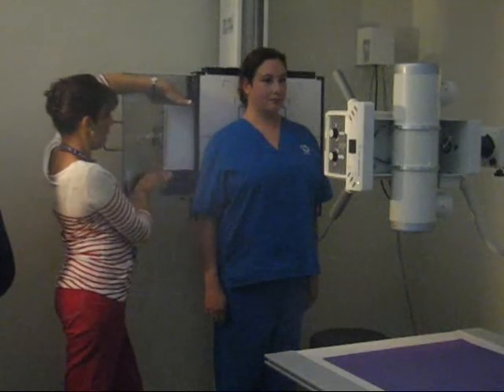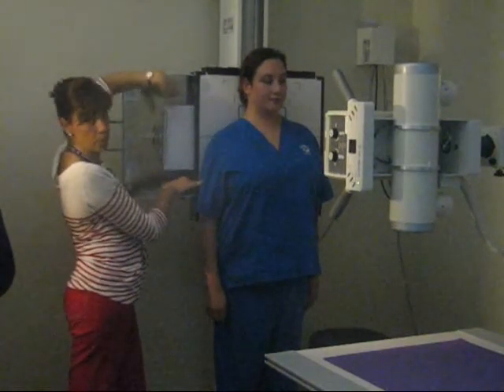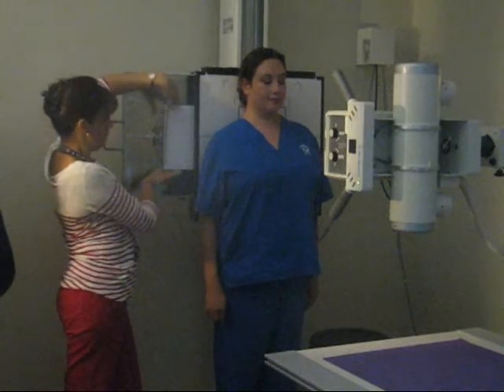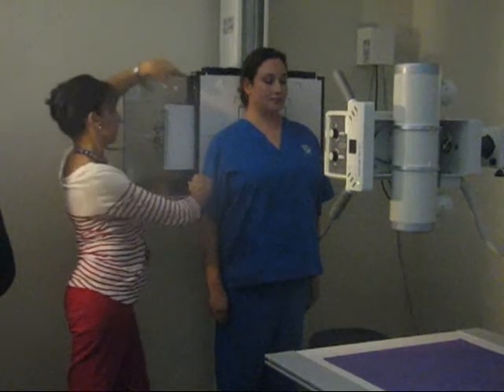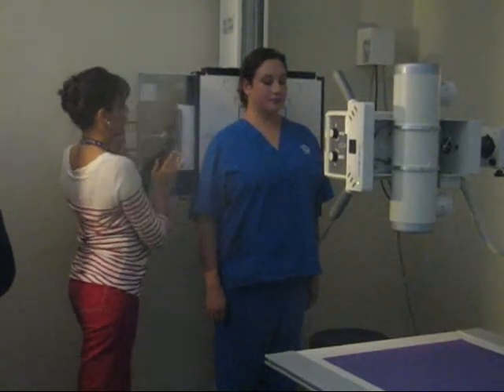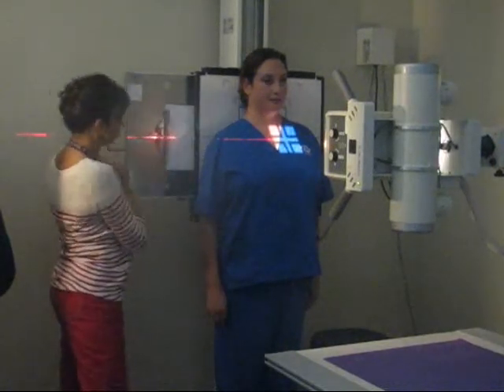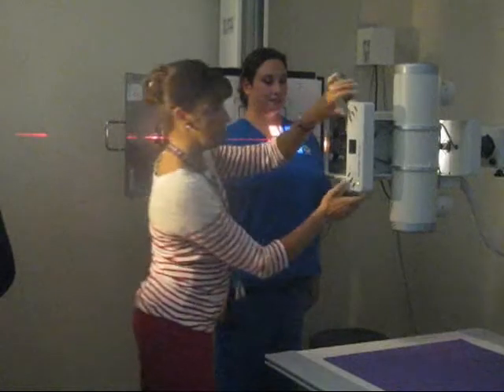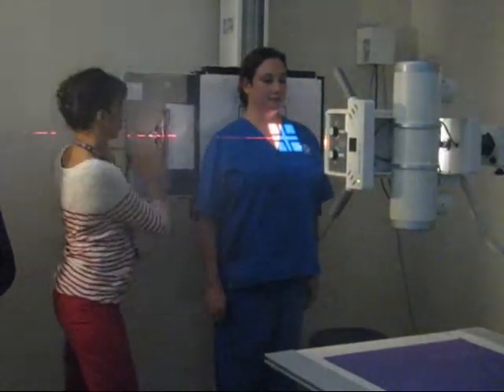You're going to want a little bit of the humerus, proximal 1/3 of humerus at least. So here you go. If you kind of try to figure out, here you are, you have about the proximal 1/3 of the humerus right here. Okay, so that should be okay. So you're going to center ray to your cassette, which is almost perfect. There you go. Okay.